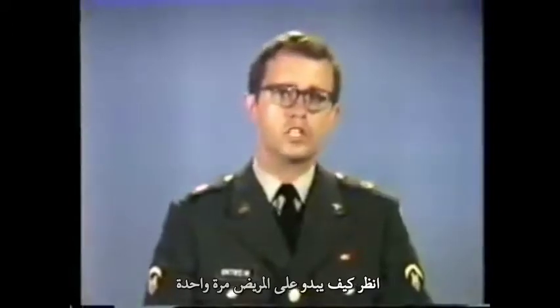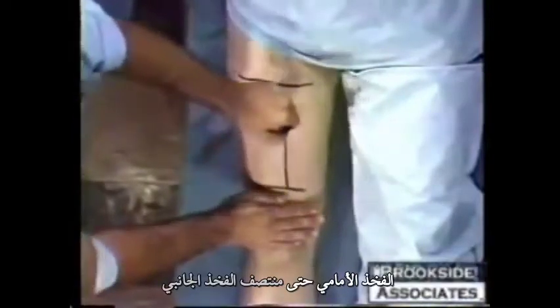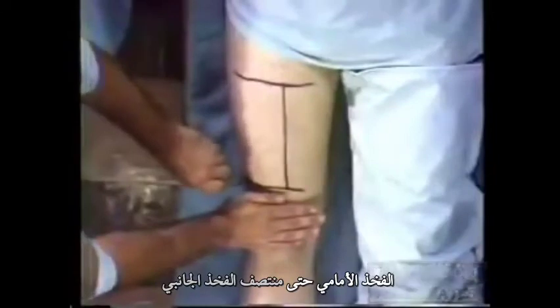Now we'll see what it looks like on a patient. Once again, a hand's breadth below the groin and a hand's breadth above the knee. The side boundaries are from the mid-anterior thigh to the mid-lateral thigh.